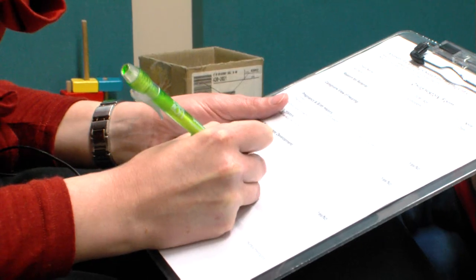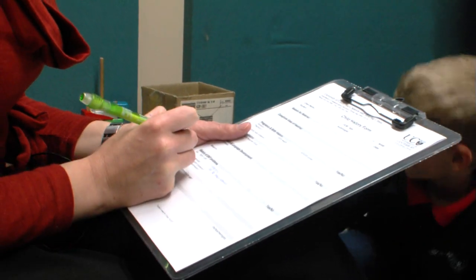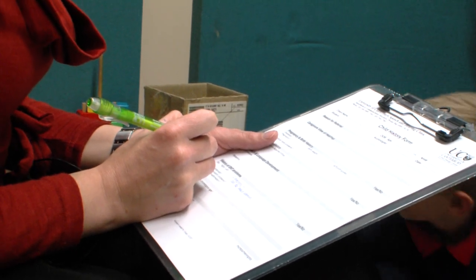So Angus, this is the first time you're coming for a hearing test. This is all new, we'll have to teach you what to do. Some questions or comments will be directed at the child directly, partly to establish rapport, but also to gauge the child's hearing abilities in an informal way before beginning to test. Would I be correct in saying that the ear infections were just treated with antibiotics? Yes, okay, yes, so he's been on a couple of rounds of antibiotics.